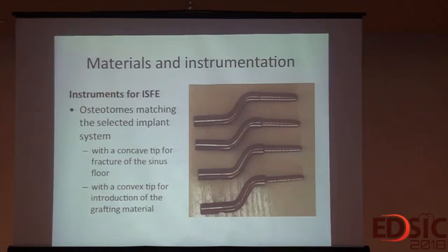These instruments are used for internal sinus elevation: osteotomes matching the selected implant system, with a concave tip for fracture of the sinus floor, and a convex tip for the grafting material.